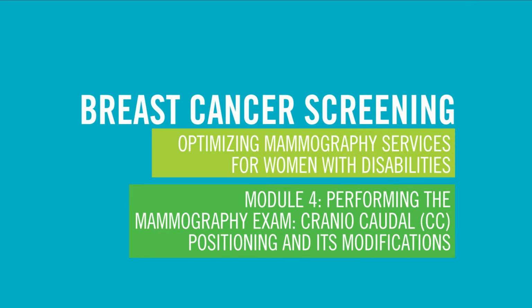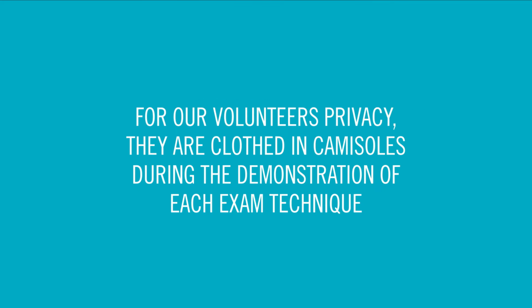Module 4, Performing the Mammography Exam, Craniocaudal CC Positioning and its Modifications. For our volunteers' privacy, they are clothed in camisoles during the demonstration of each exam technique.